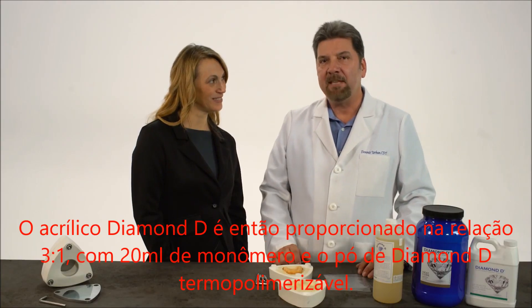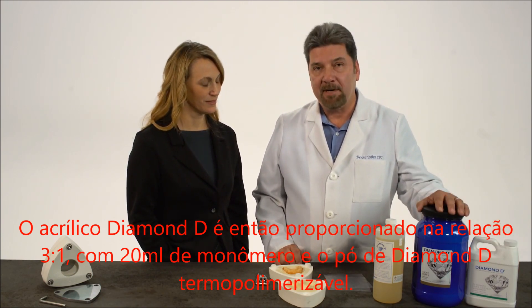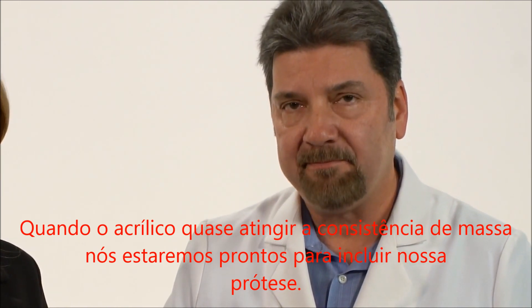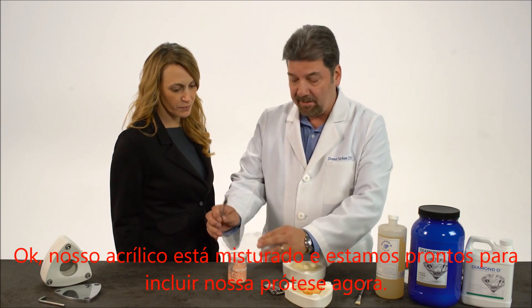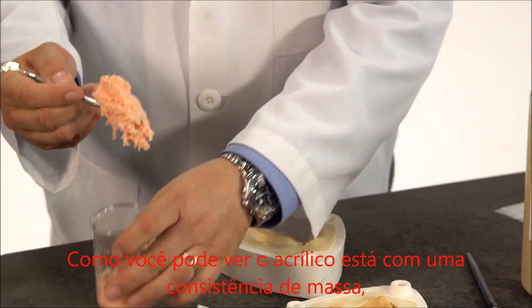The Diamond D acrylic is then mixed at a 3 to 1 ratio with 20 ml monomer and Diamond D heat cured polymer. When the acrylic gets almost to a doughy consistency, we're ready to pack our denture. Our acrylic is mixed, and as you can see, the acrylic is to a doughy consistency here.